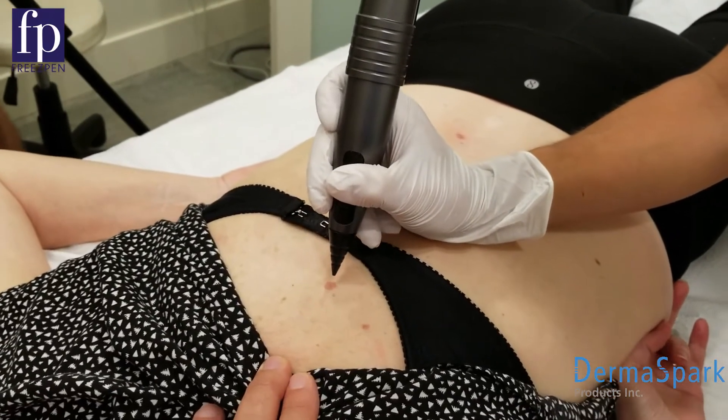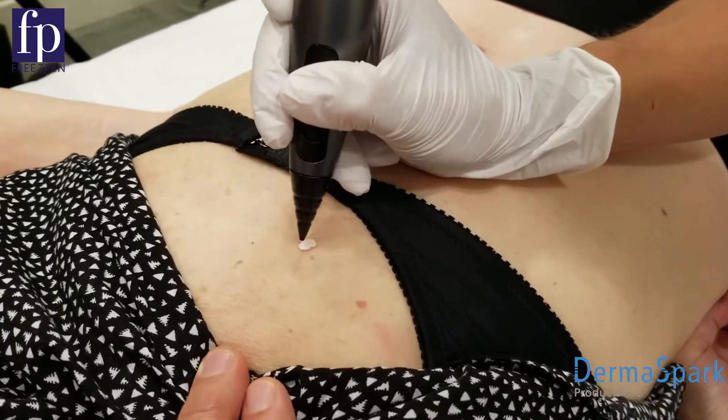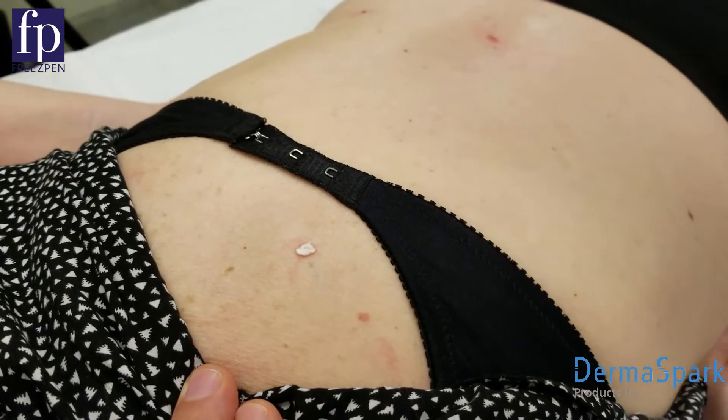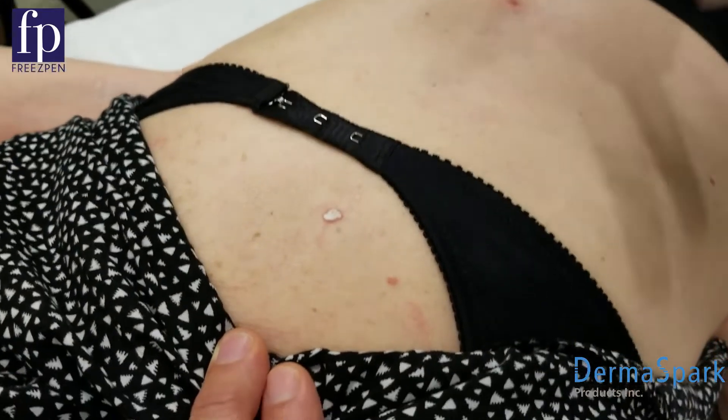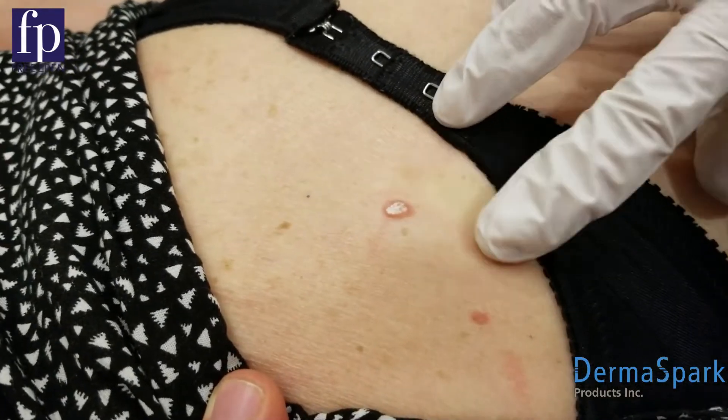The nitrous oxide cartridge runs at negative 89 degrees Celsius, negative 127 Fahrenheit. You can see where I'm just going in these little circular motions to break off those ice crystals so it can penetrate down to the base of the lesion. It's a freeze-thaw-freeze method, so I'm going to freeze it once and watch it fall out.